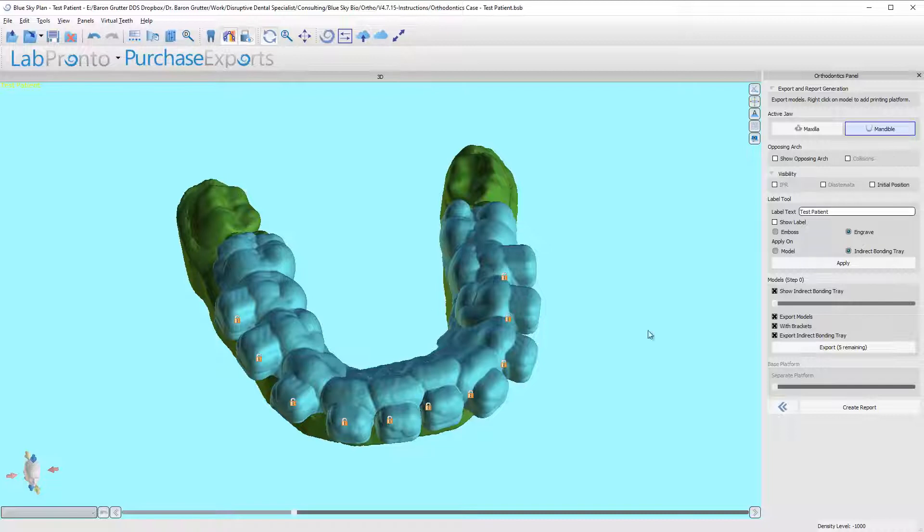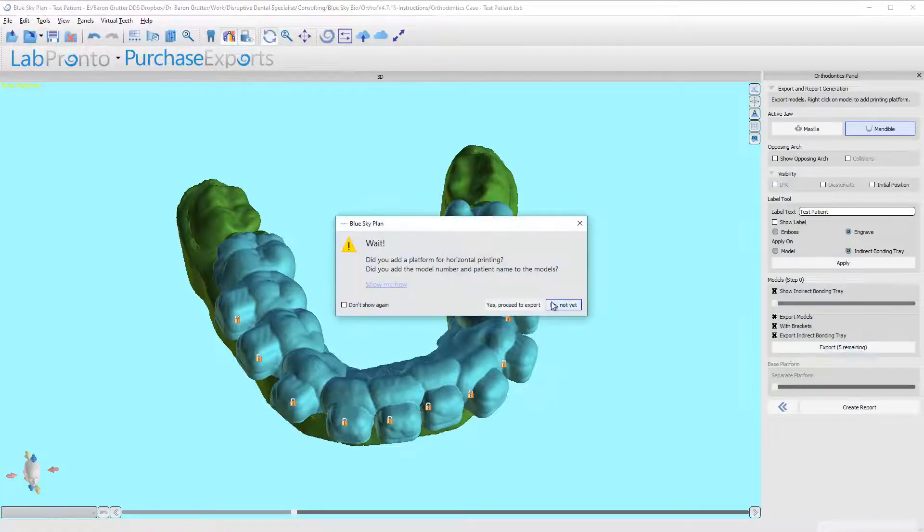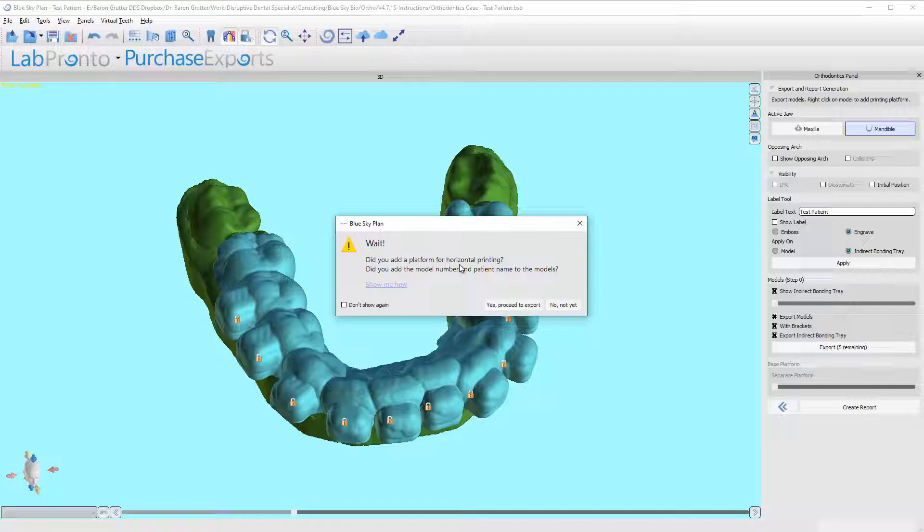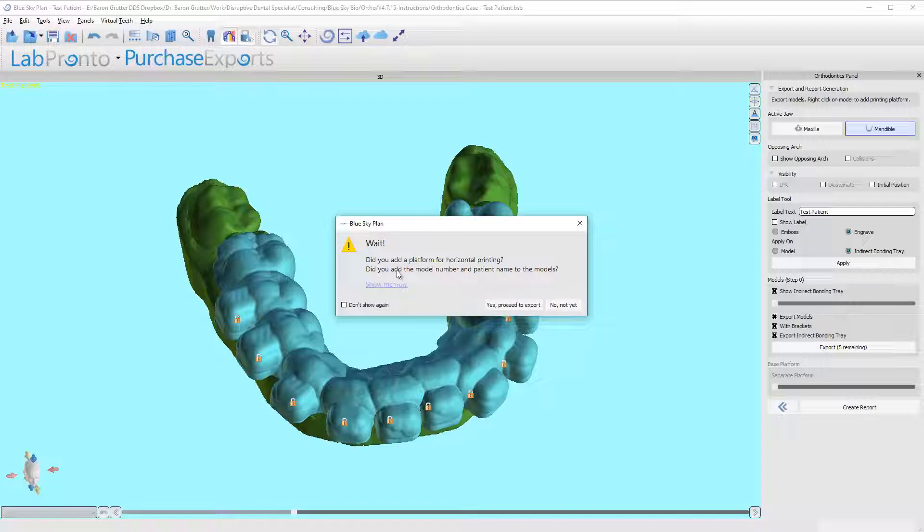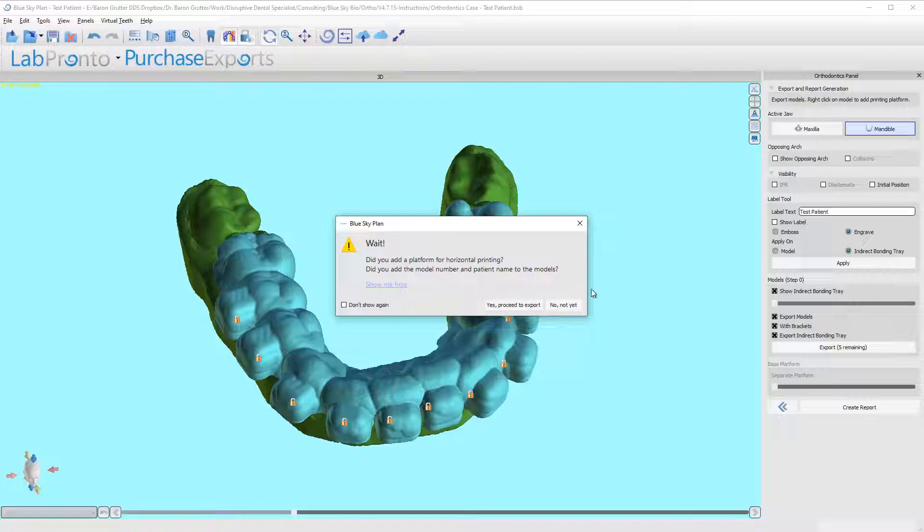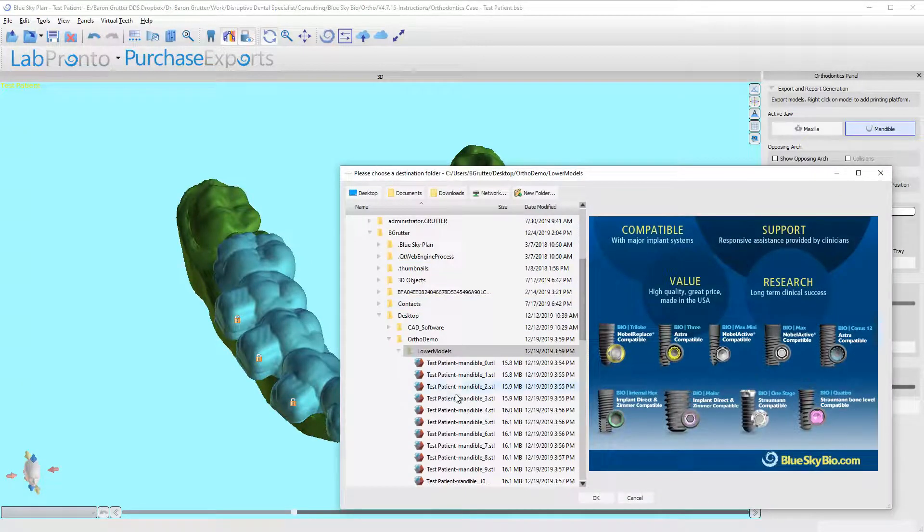So I'm going to click on export. It's once again asking me: do you add a horizontal support? Just like in the aligner software, it's asking do you add a print platform for horizontal printing, do you want to add a model number to the models? We don't need a horizontal print platform for a tray. We do need to add a label which we've already done. Okay, so I'm going to say yes, proceed to export.